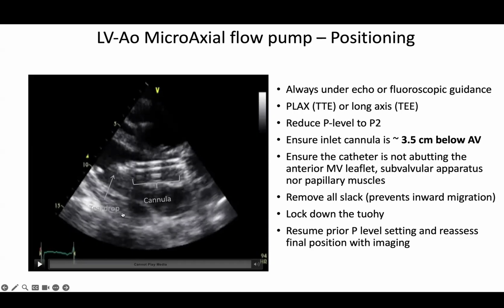That can happen, and that's where complications happen, i.e. suction or more hemolysis. It's important that every time you reposition or you finish a case with an Impella, you deal with the slack in the system. You have the drive line, and at the end of the case you have to make sure that drive line gets straightened out, and also lock the Tuohy at the repositioning sheath to prevent movement of the device.